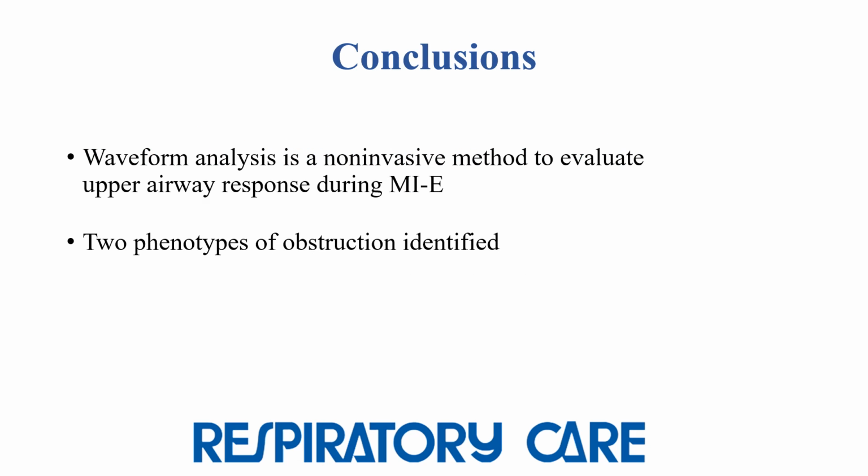In conclusion, waveform analysis is a non-invasive method that can be used to evaluate upper airway response during MIE therapy, and the authors identified two phenotypes of obstruction for subjects with ALS.